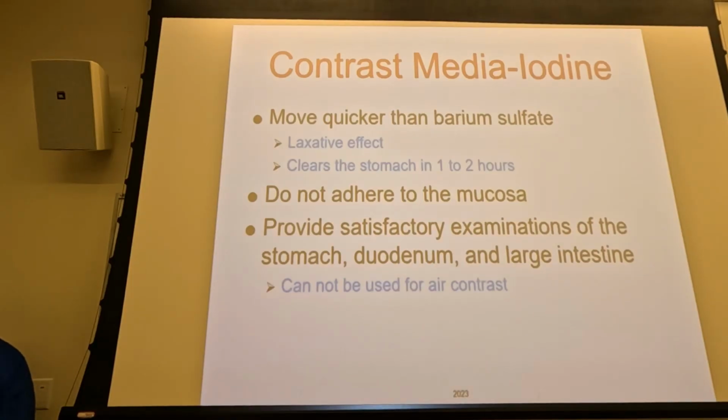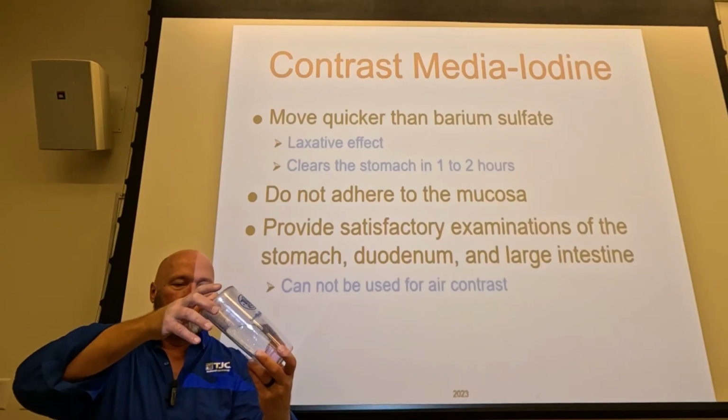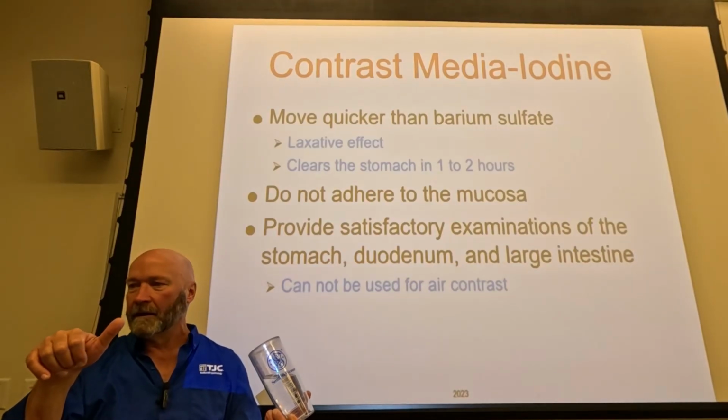So the problem with iodinated contrast, in addition to the potential allergic reaction, is that it does not adhere to the mucosa well. So it'll show whether or not it passes, but it doesn't line the mucosa very well. So think of it kind of like, let's say, having a little bit of tea in a glass and rotating it around, like this. How well does the water adhere to the cup? It doesn't. It doesn't at all, right? I can reach in there and I didn't even bring any moisture out of that, right?